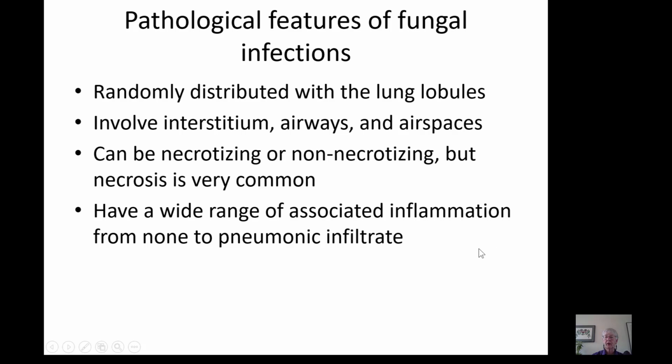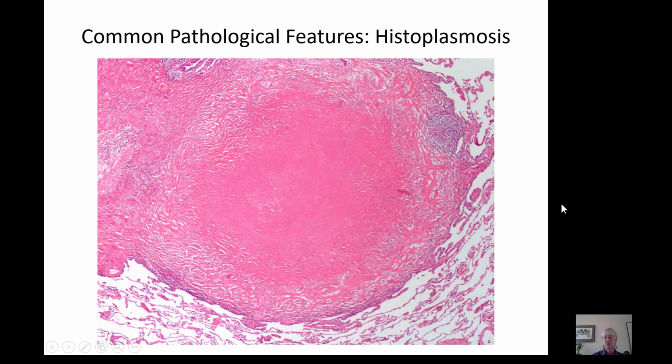And they have a wide range of associated inflammation, from none to a pneumonic infiltrate to the granulomata that we're talking about in this session. I don't want to give you the idea that all fungal infections are granulomatous, so I'm going to illustrate some of the wide variety of inflammation that can be associated with the fungal infections.